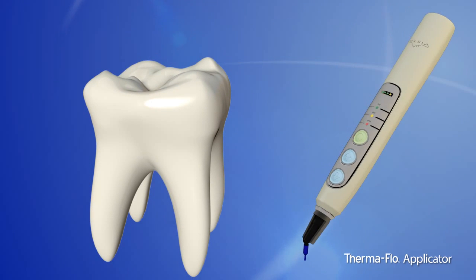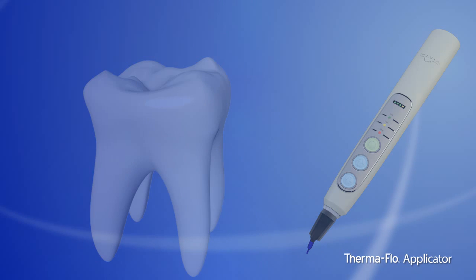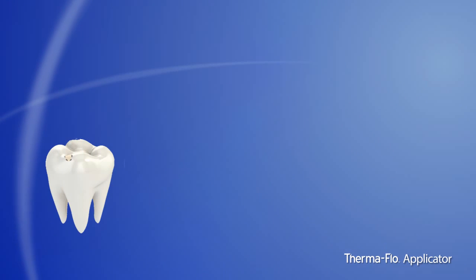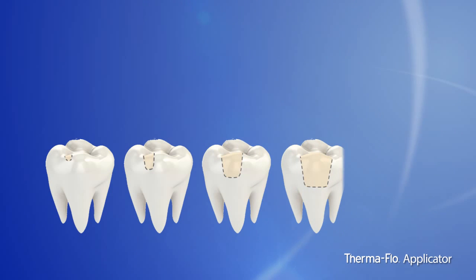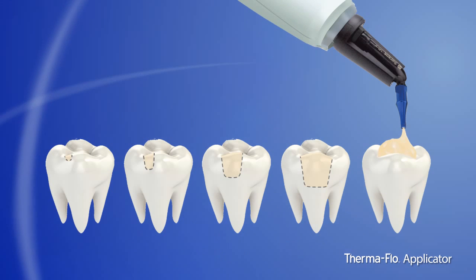Heating composite material is a growing trend in dentistry, as more and more doctors are realizing the benefits. The applicator allows you to use highly filled composites in more types of applications, offering the same clinical ease of flowable composite without sacrificing strength, hardness, shine retention, and wear resistance.